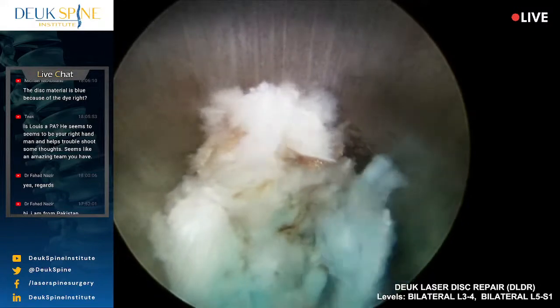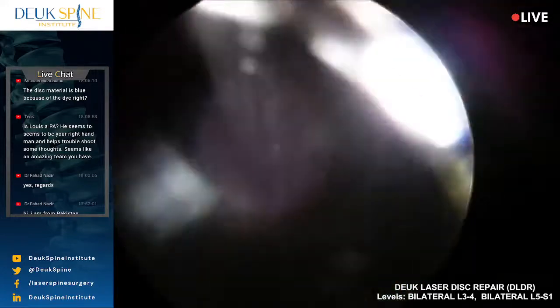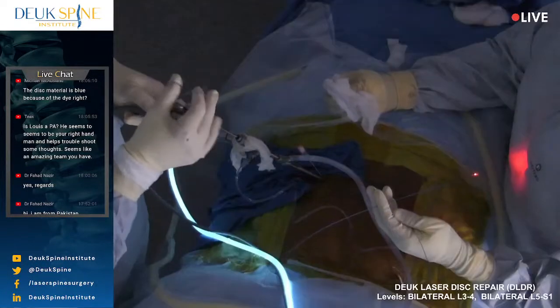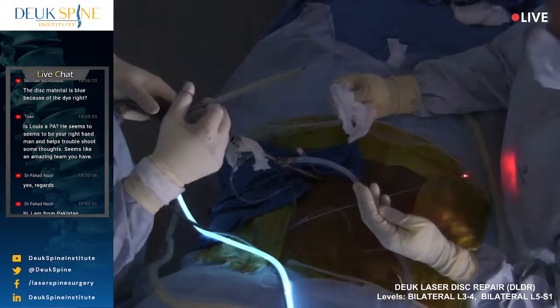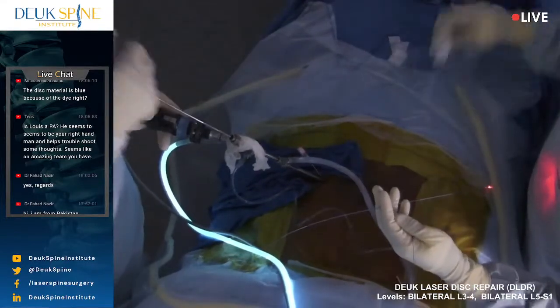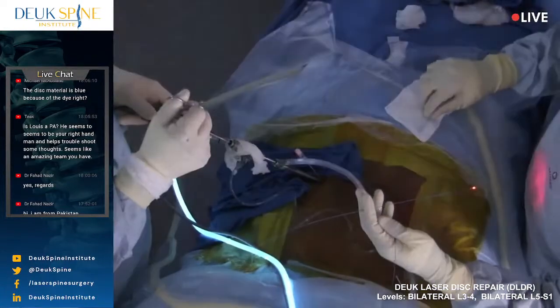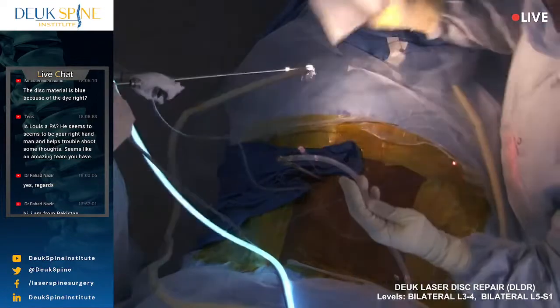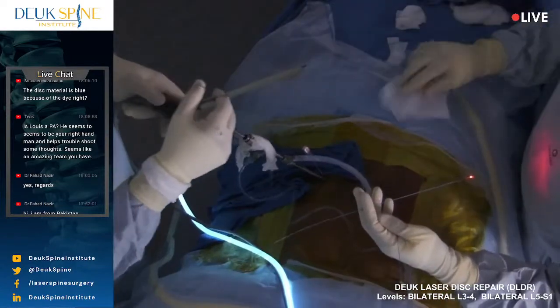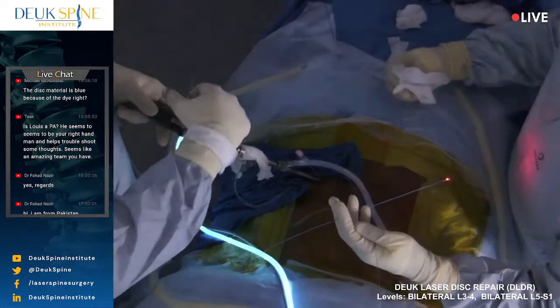So much herniation. We have another question from YouTube. They're asking, is Luis your PA? He seems to be your right-hand man and helps troubleshoot some things. Seems like an amazing team you have. Luis is not my PA, but he is my right-hand man. Luis is a doctor, and he's my right-hand man.